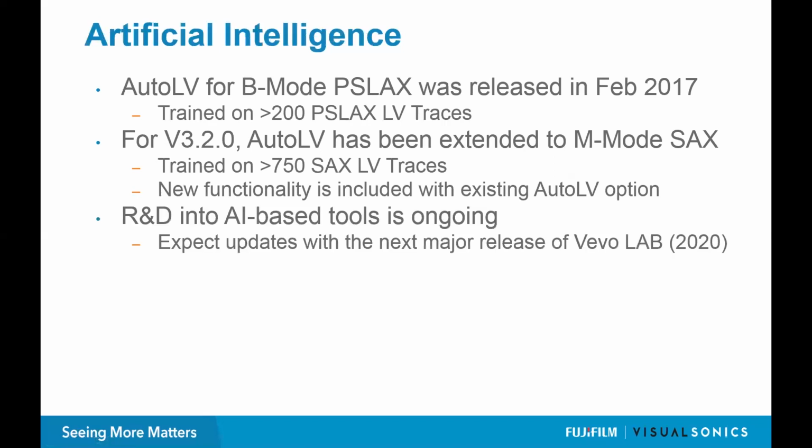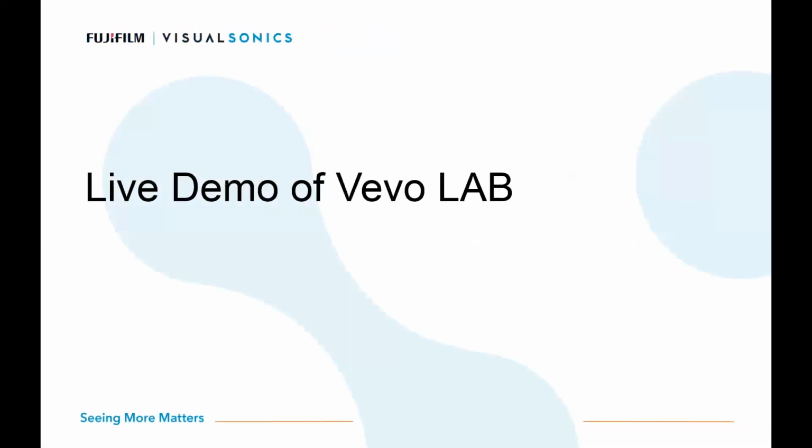And internally, research and development into artificial intelligence-based tools for data management and data analysis is ongoing. We have a number of different projects that we're working on that are in various states of development. And I would say expect to see some further updates to either some of these tools or new tools coming with the next major release of Vevo LAB, which is planned for next calendar year, 2020. And I think at this point, with the power of these tools, we will continue to see going forward the functionality and the availability of them expanding and growing as we start to move out into that area.